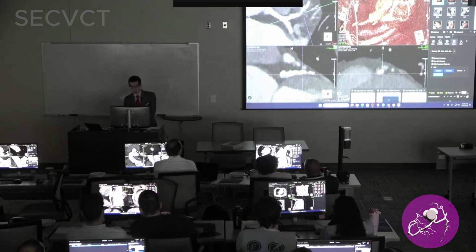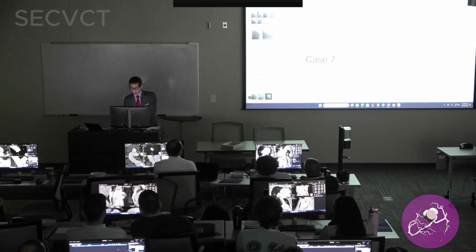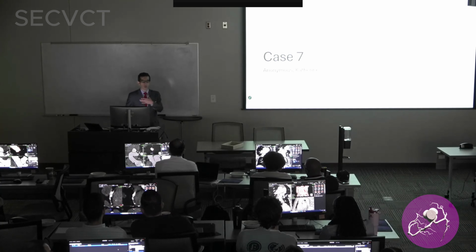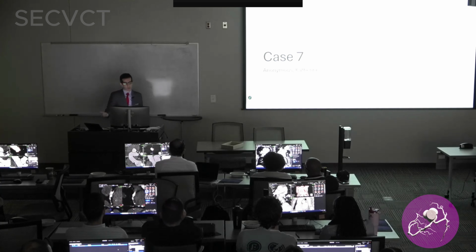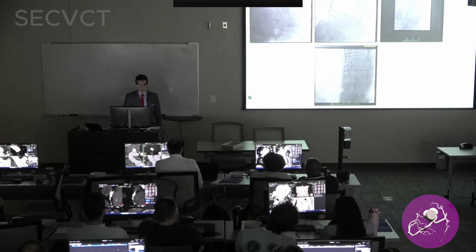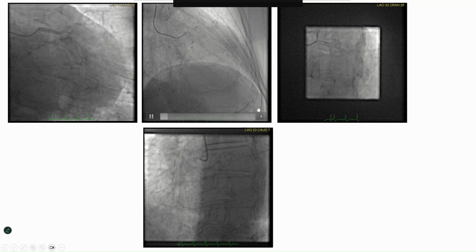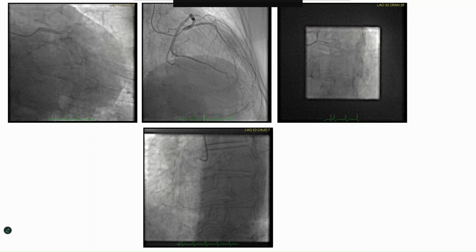So I just want to share with you some slides on this specific topic, about the use of TAVR CT. Remember, TAVR patients usually have some degree of moderate to severe AS. We do not give nitroglycerin. They do have calcification in the valve, so a lot of times they also have concomitant CAC, coronary artery calcification. So just keep in mind that the use of TAVR CTA to assess the coronary arteries can be limited.